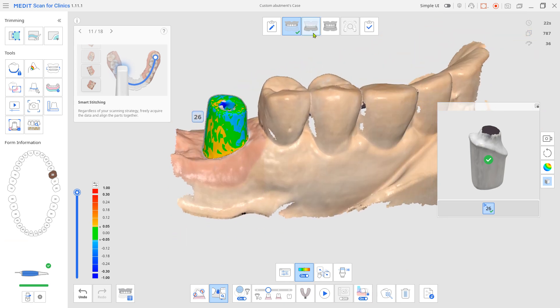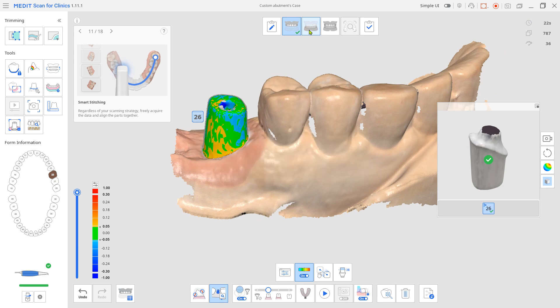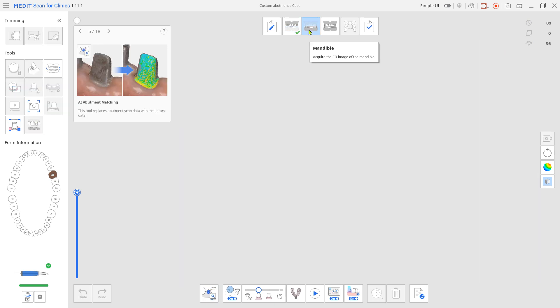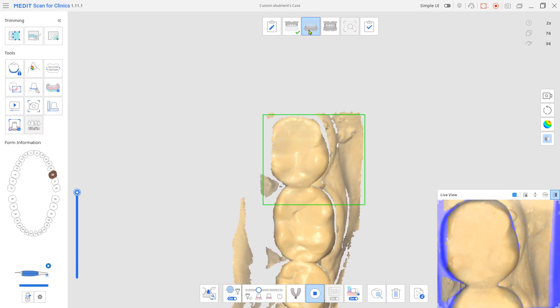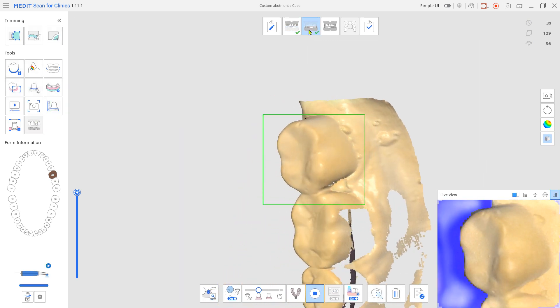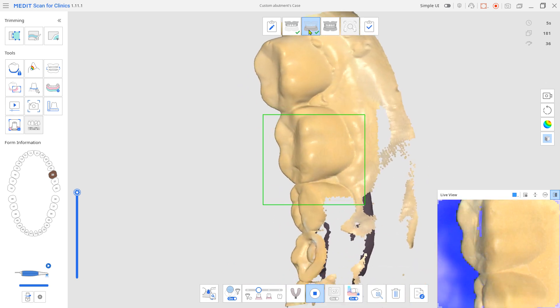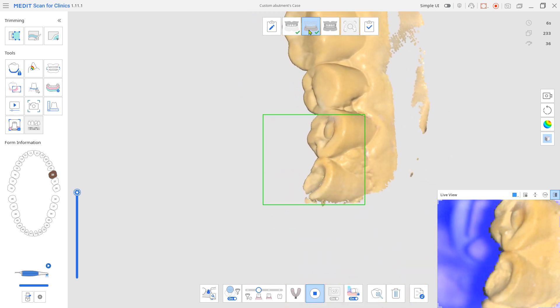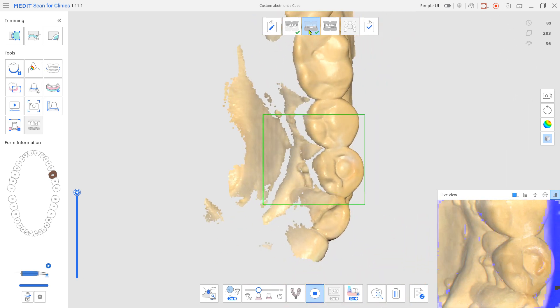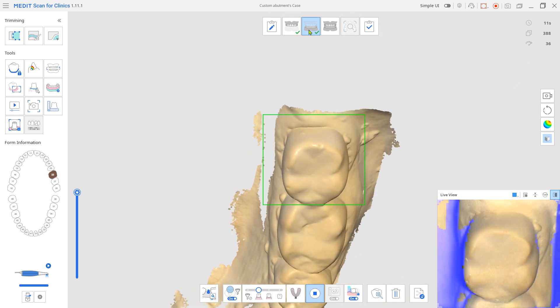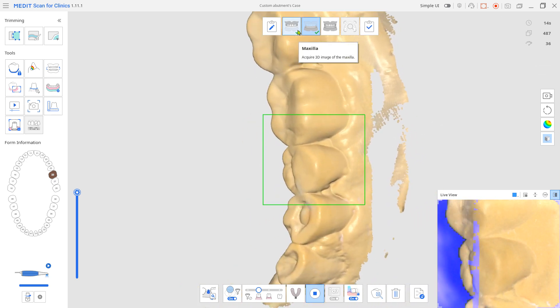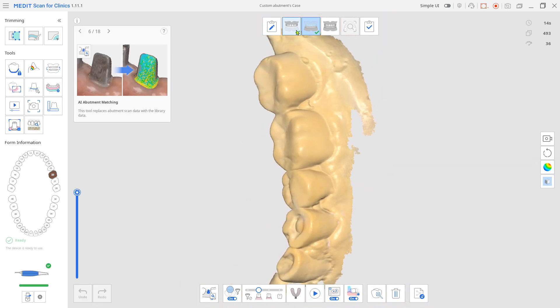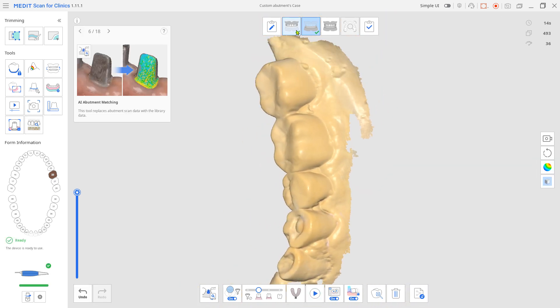Scan the antagonist. Have your patient close bite, then scan the occlusion.